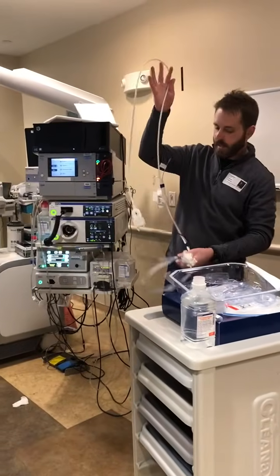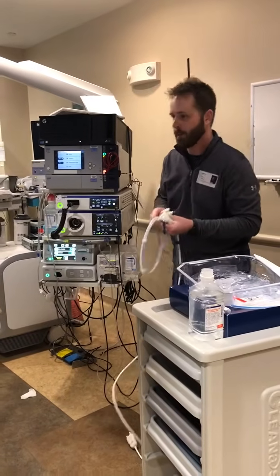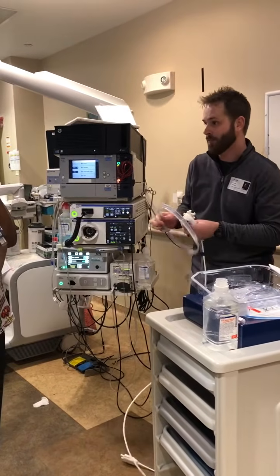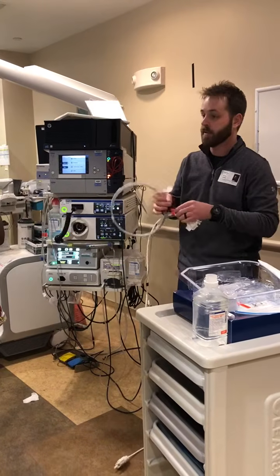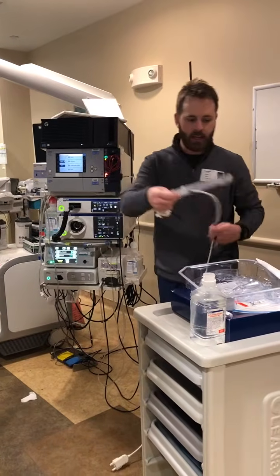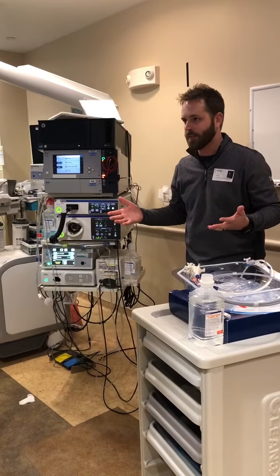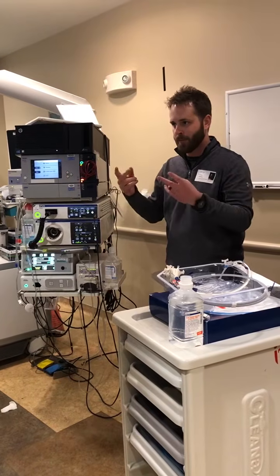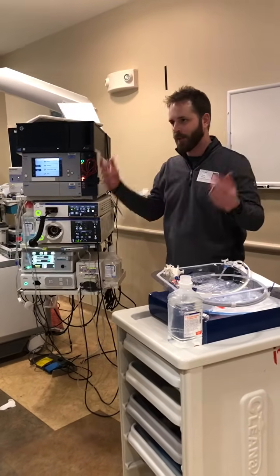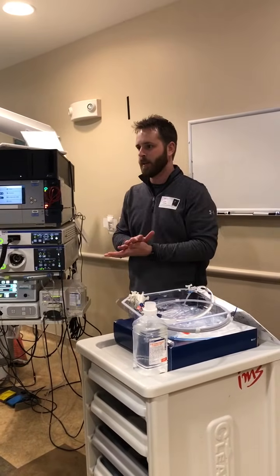The concept of cholangioscopy has been around since the 1970s. I promise this isn't going to be a brief history of all cholangioscopy. But the idea was that we do colonoscopies and EGDs with direct visualization, so why do we work in ERCP with fluoro and two-dimensional images of a three-dimensional structure? So how do we get inside the biliary tree and actually see what's happening?